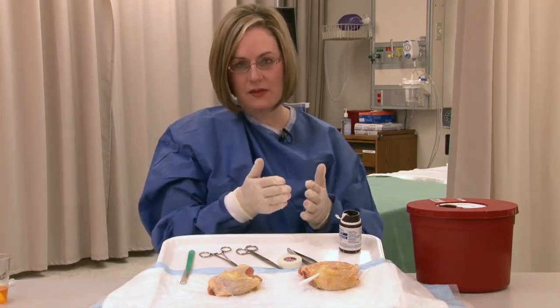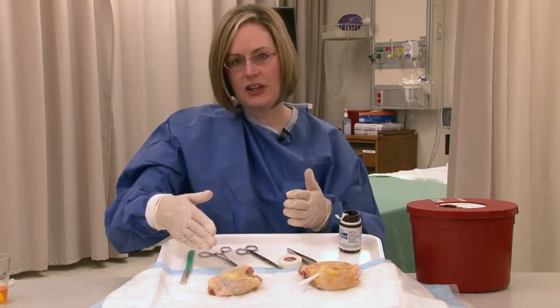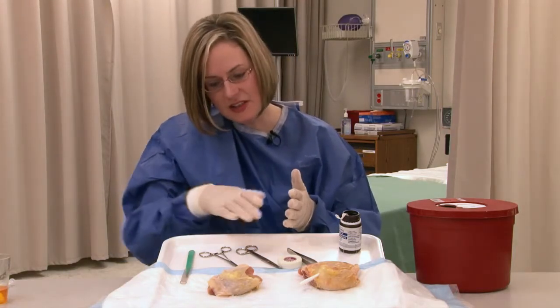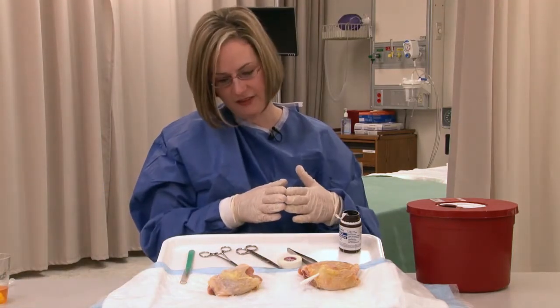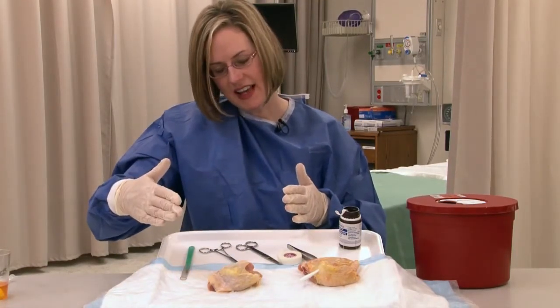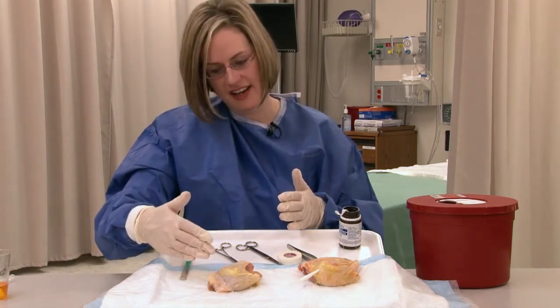You can practice going through all of the motions and use iodoform packing, much like you would pack an incision anywhere else on the body. So I'm going to demonstrate this using the same pus pocket under the skin of a chicken fryer. So we're going to pretend that I've already cleaned the area and gone through the steps of obtaining informed consent and using lidocaine to numb the area.